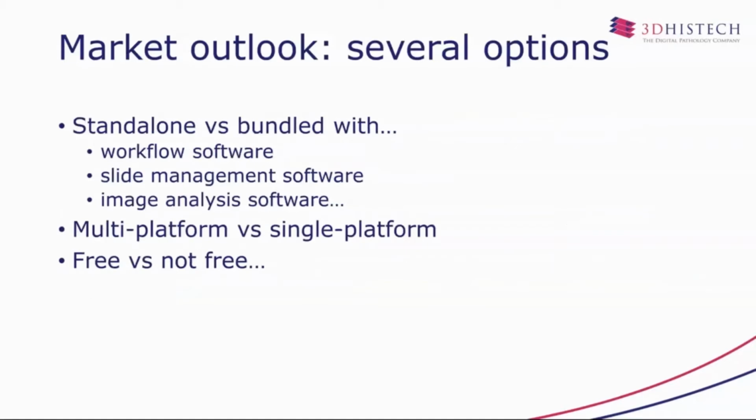Okay, market outlook. There are several options out there in the market. There are standalone viewing solutions versus bundled solutions, bundled with workflow software, slide management software, image analysis software, etc. There are multi-platform solutions, there are single platform solutions, and obviously some of them are free and some of them are not free. So this is all about the short introduction.